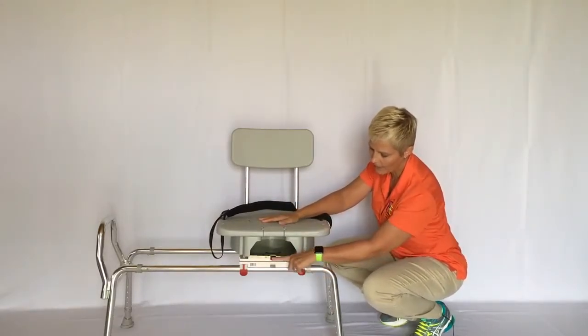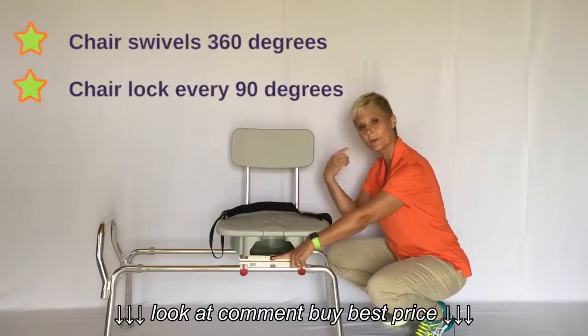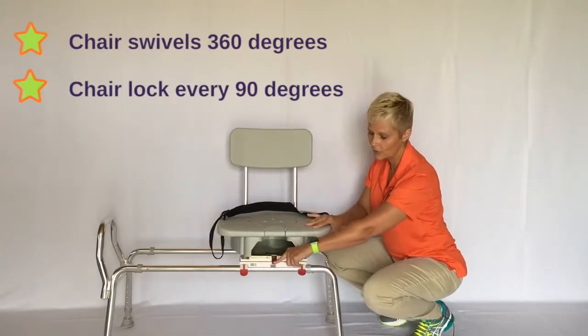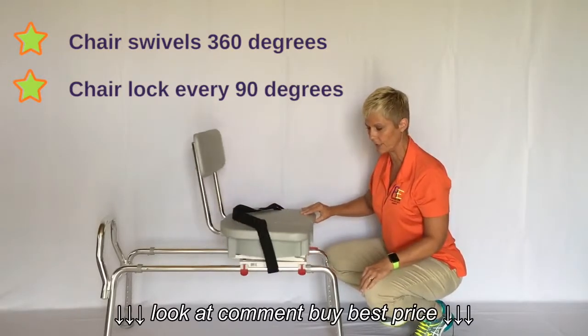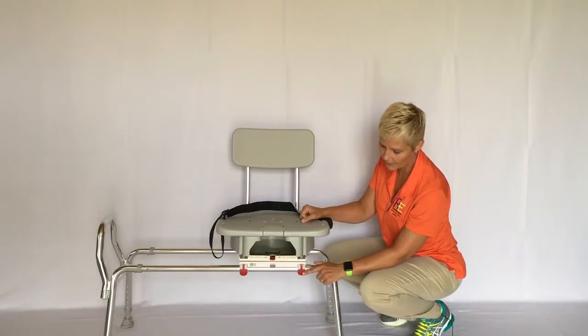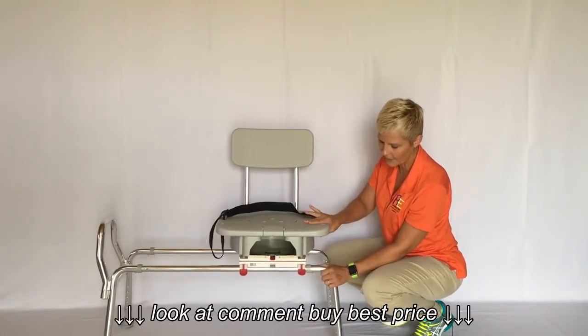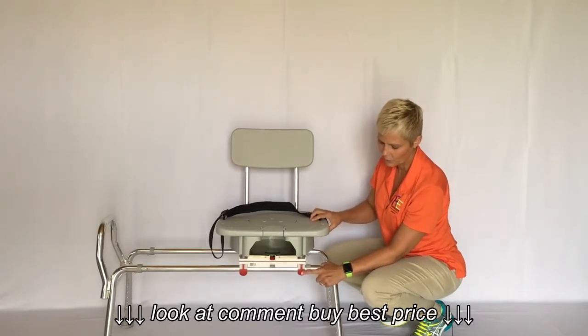The lever here is for the swivel part of the chair. This chair will swivel 360 degrees and locks every 90 degrees — you can hear that lock right there. The two smaller levers release a push button; the seat is locked at the end of the carriage, and pushing the lever down releases it so it will slide.